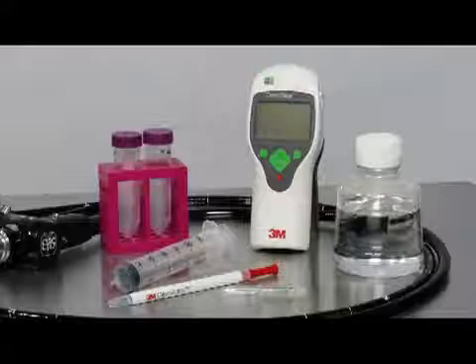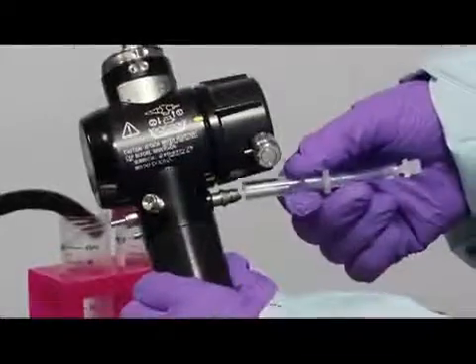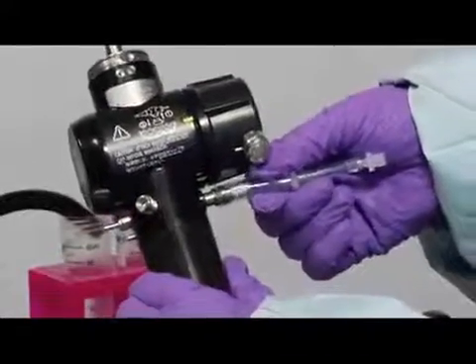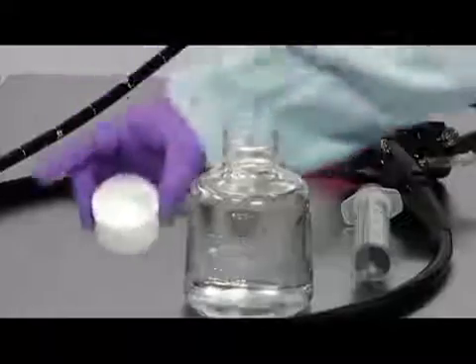Your next step is going to be gather your supplies to test the suction biopsy channel. First thing you want to do is put the distal end into whatever sample collection cup that you've got going. You want to make sure that that distal end is not going to be covered by the 40 mils of water. Put your connector on the light guide end and then get 40 mils of water into your syringe.